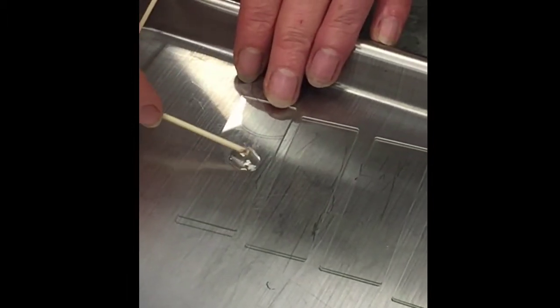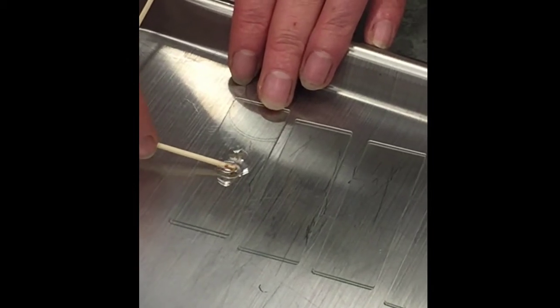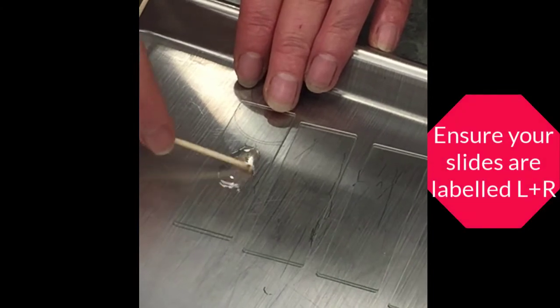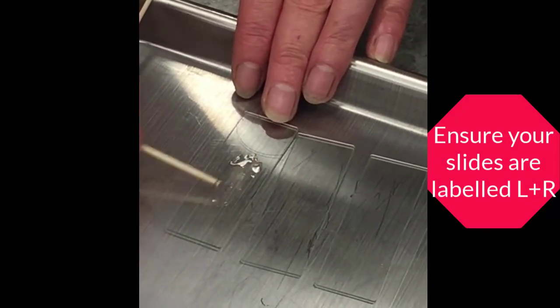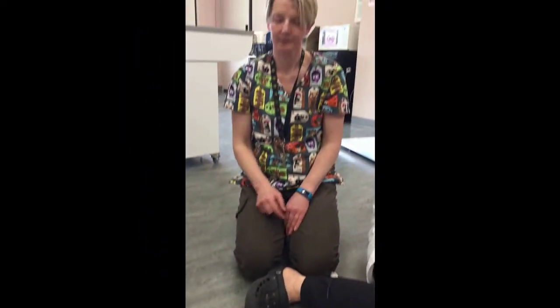And then I'm going to get a drop of mineral oil. Now if this was particularly cats with ear mites, they tend to have lots of really dry wax. I'm actually going to break that wax up in the mineral oil with the reverse end of the stick here, so that they don't remain as big chunks for when I look at it under the microscope. Okay, so that is the sample that I'm going to look at for ear mites.